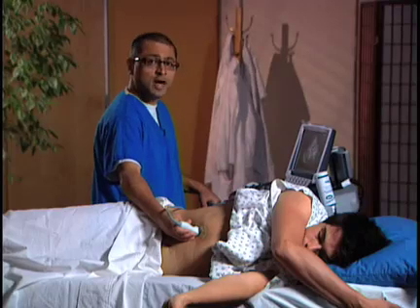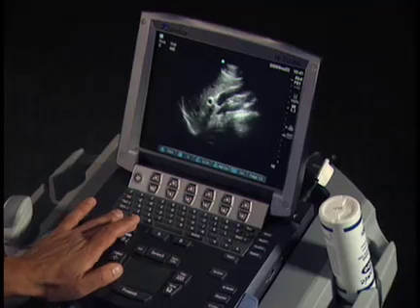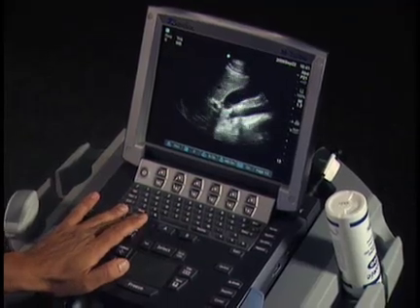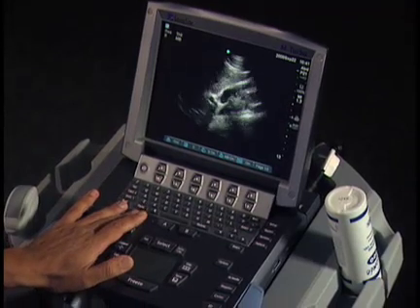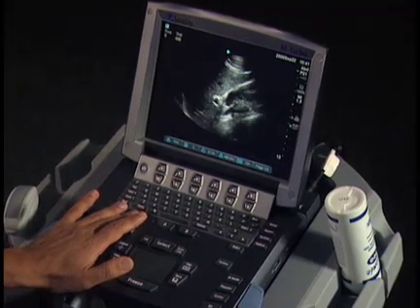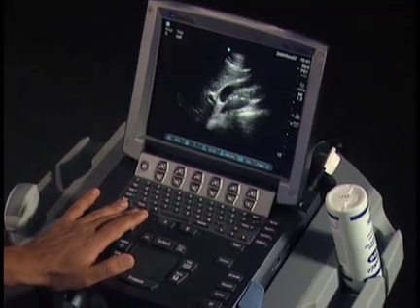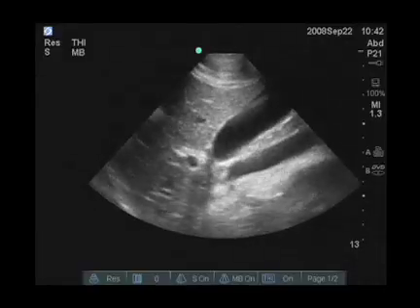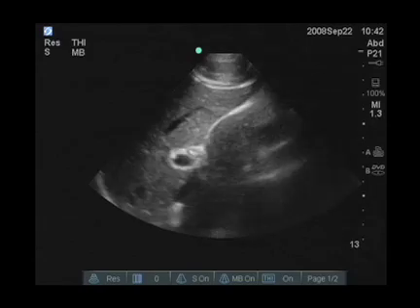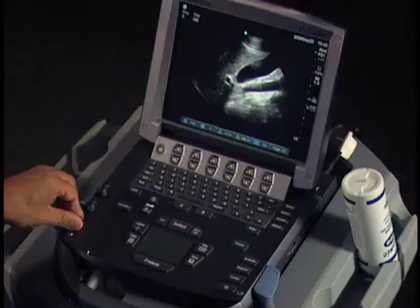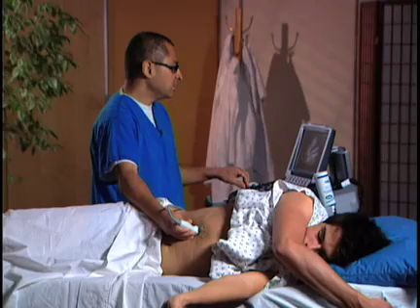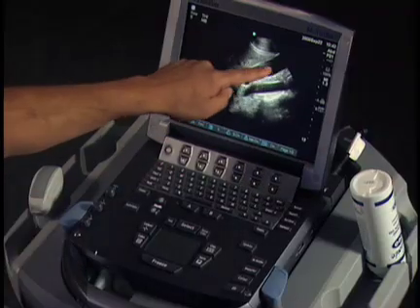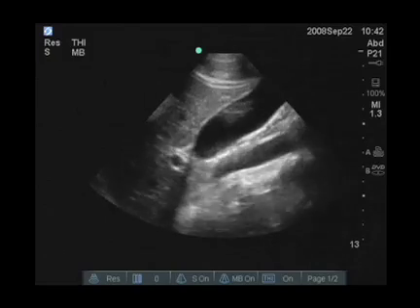Things you can do to optimize the image: first, you can change your depth. In this gentleman, I may decrease the depth slightly to bring the gallbladder better into the mid-center field of view. The other thing I can do is adjust the gain slightly — playing with it higher makes the image brighter, or slightly lower. You want to optimize these settings so you have good contrast of the fluid-filled structure, which is the gallbladder in the center, and you can also notice any artifacts.